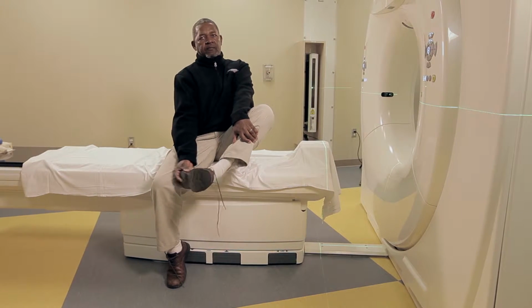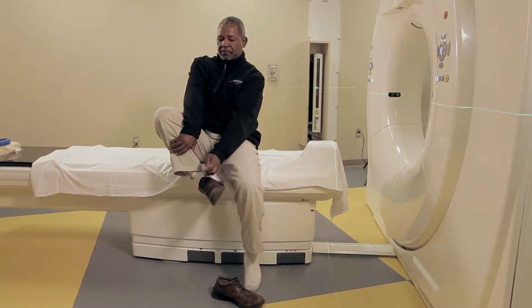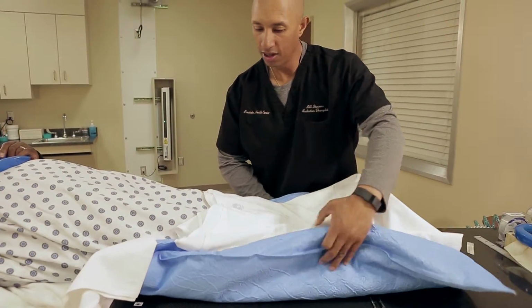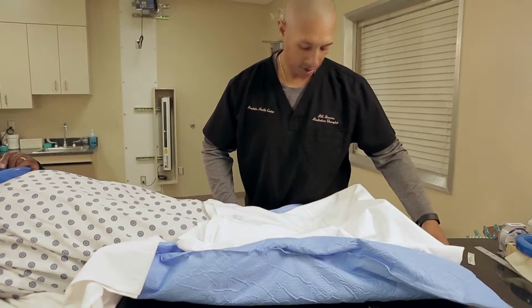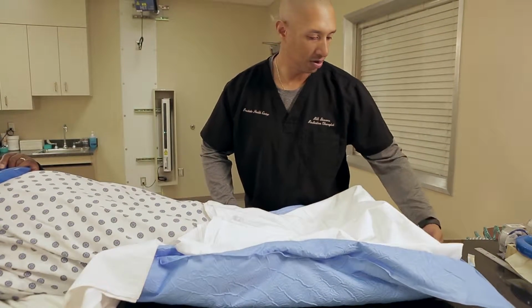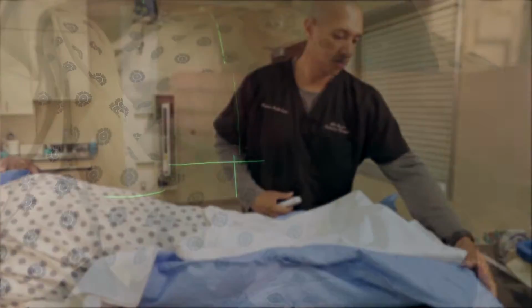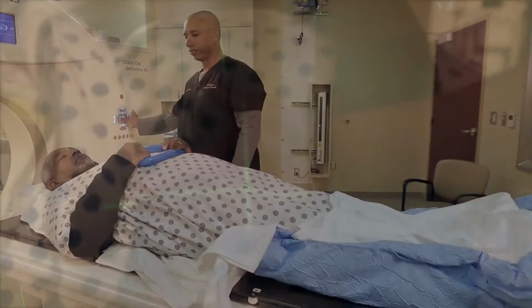Once you arrive at the facility, you'll be given fluids and an enema. You'll remove your shoes and lay down on the table. Then a custom mold will be prepared. This mold will be used for the duration of your radiation in order to immobilize your legs and lower body so each radiation treatment is consistent. The machine's lasers are not at all harmful to the body.